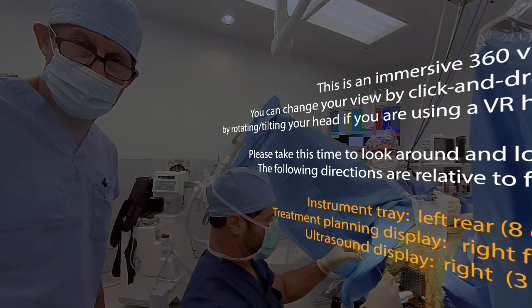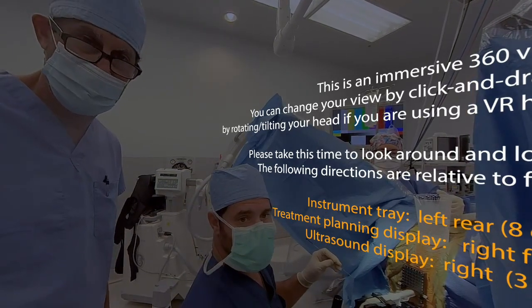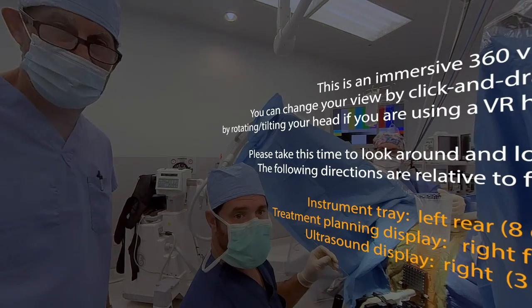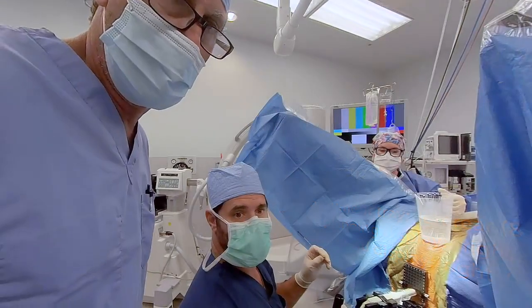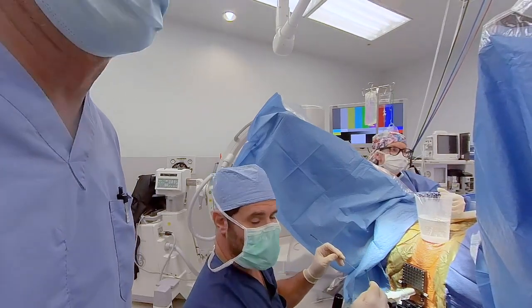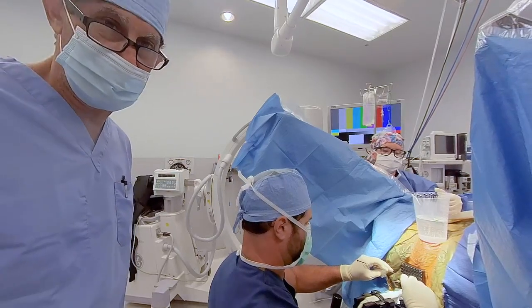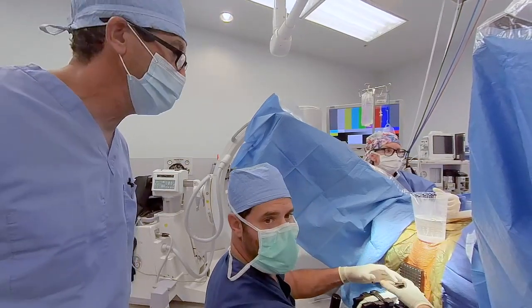And I'm Adam Raven. I'm a radiation oncologist at Christiana Care, and we're doing a prostate seed implant today with I-125 radioactive sources. The first thing we're going to do is localize the prostate on the video screen in the transverse mid-gland image, and then we place two anchoring needles on the outside lateral edges of the gland.